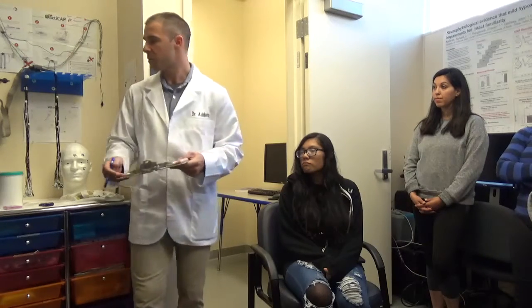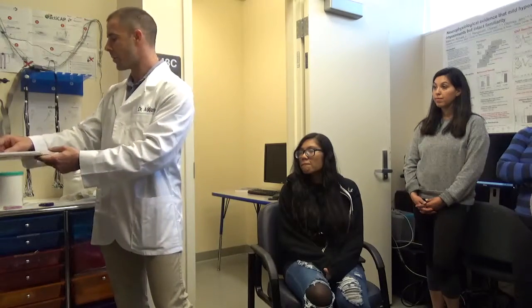Okay, so what we will explain is basically each element of the study. And to explain the elements of the study, it requires explaining the equipment that we're going to use. So, Stormy, right? Yes. All right, awesome. Thank you for volunteering. What we're going to do is conduct some pretty interesting studies about how people make various kinds of basic decisions, some basic judgments, and we'll get to record some really cool physiology of brainwaves when we do it.